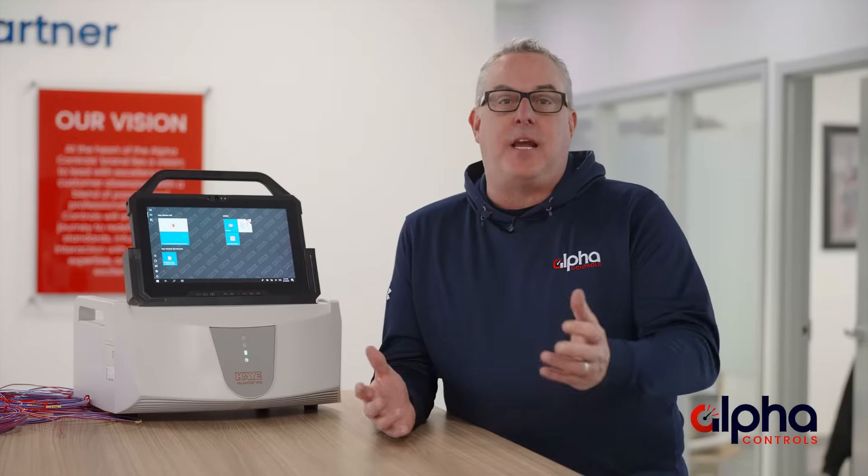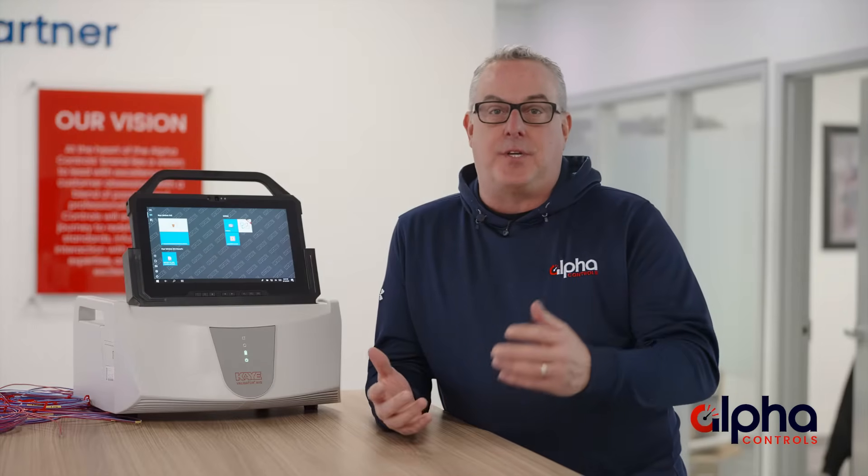The Validator AVS is a game changer for validation in industries such as life sciences, healthcare, and food and beverage. It's designed to make sure critical equipment like sterilizers, freezers, autoclaves, and even incubators are running safely and meeting all the specific requirements for the regulatory bodies.